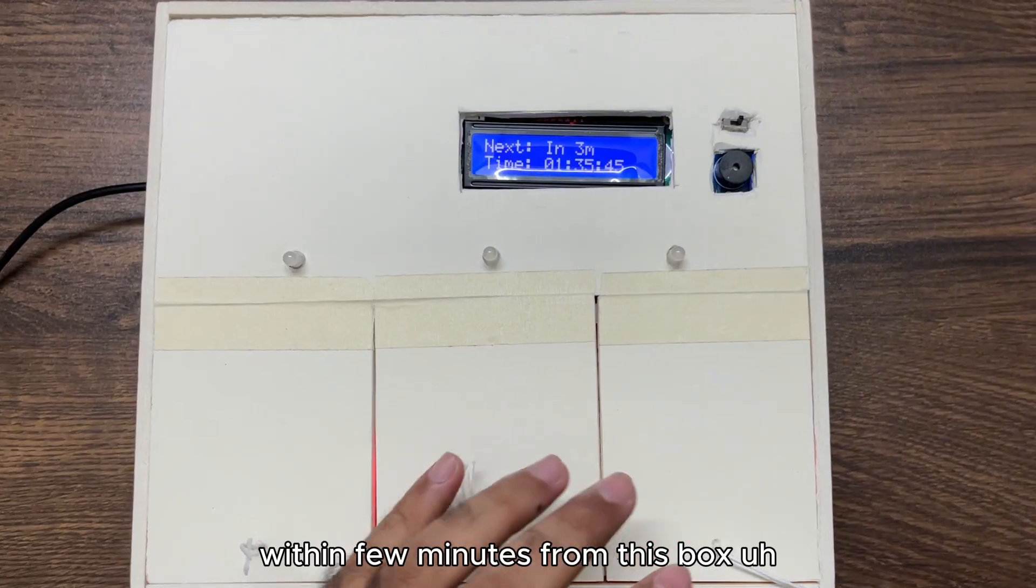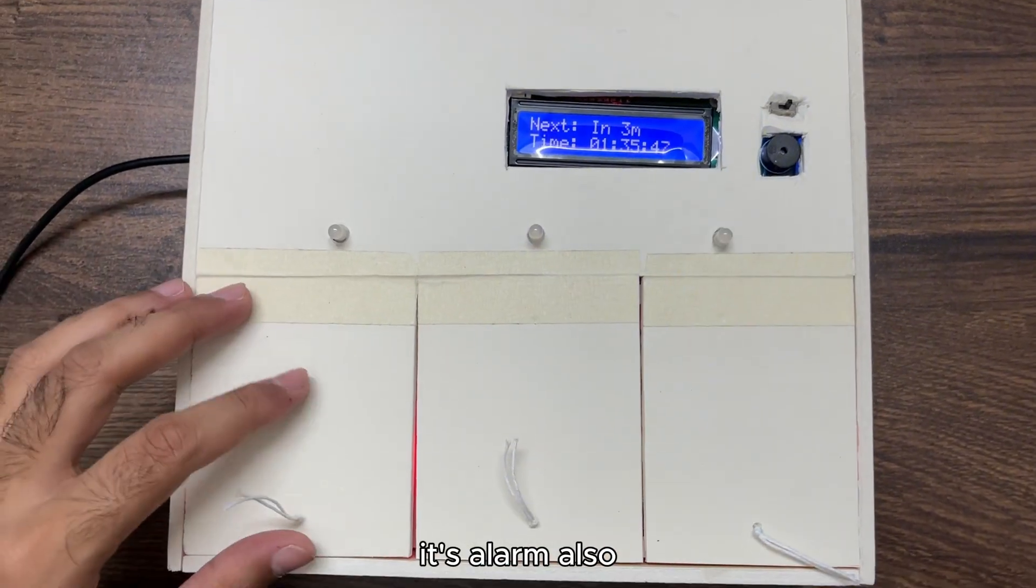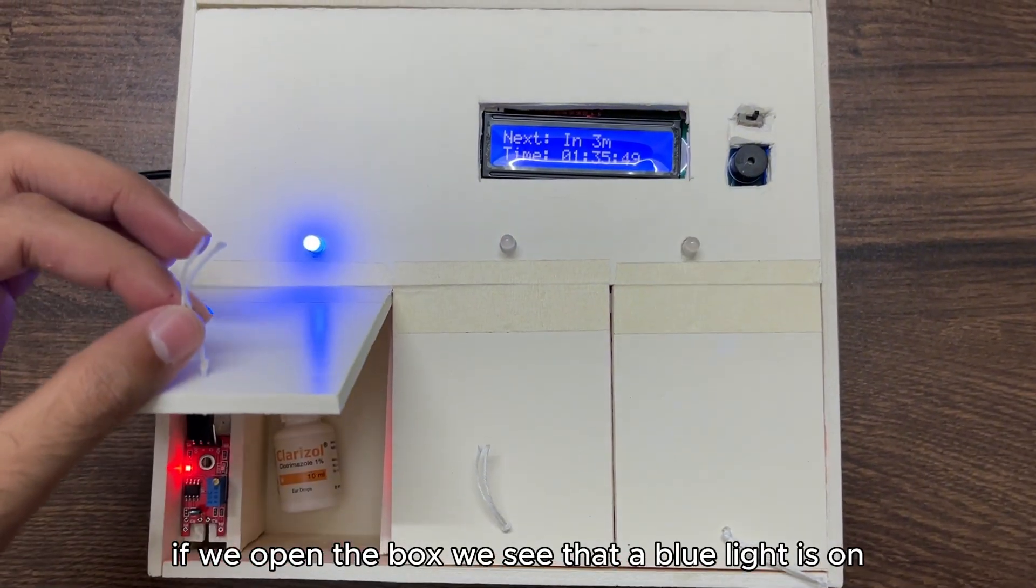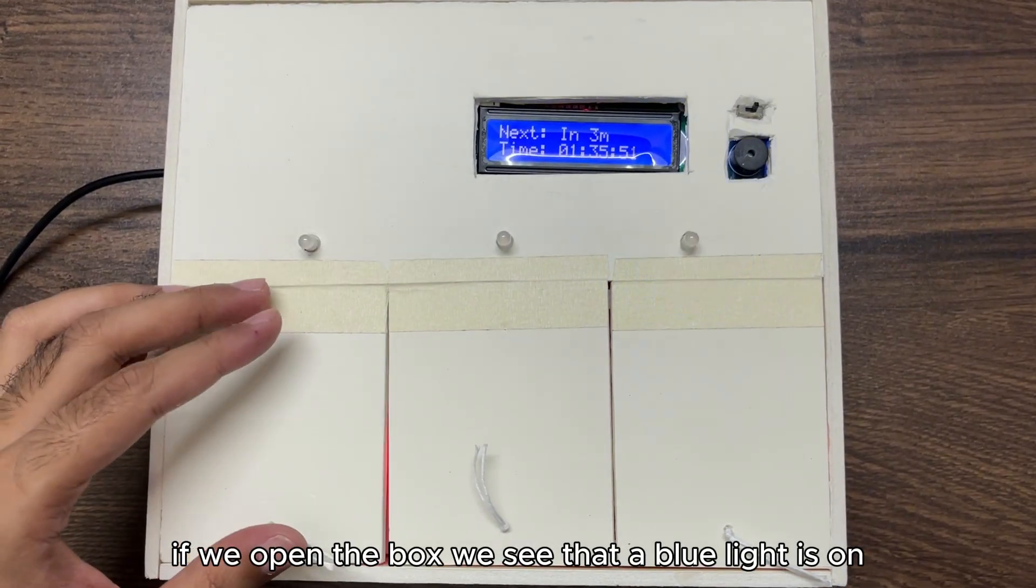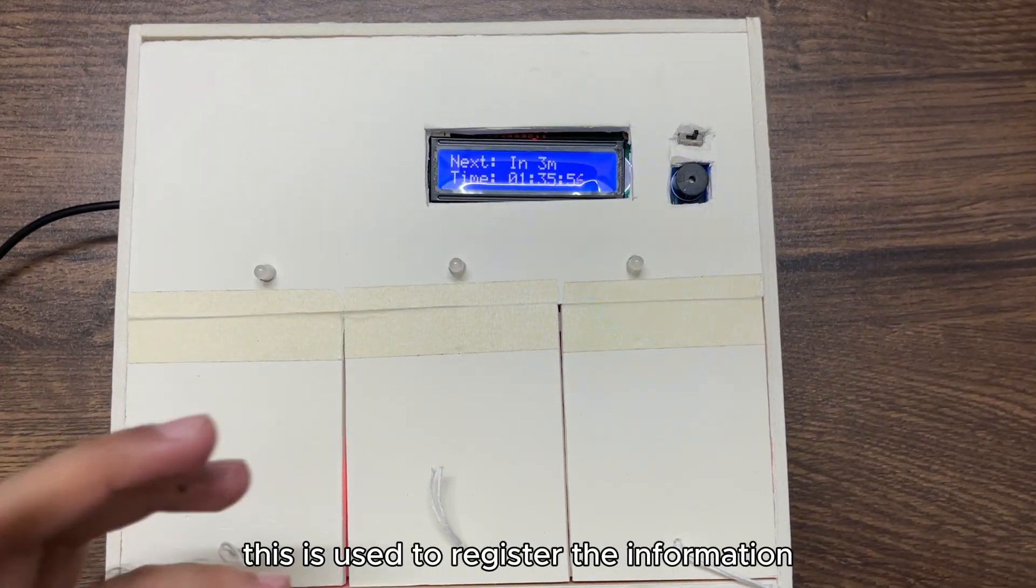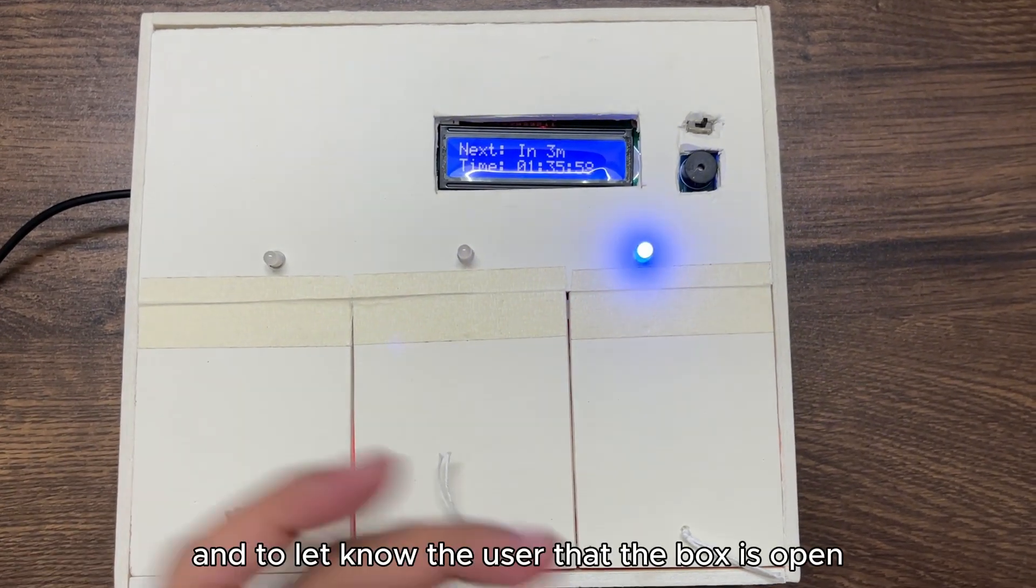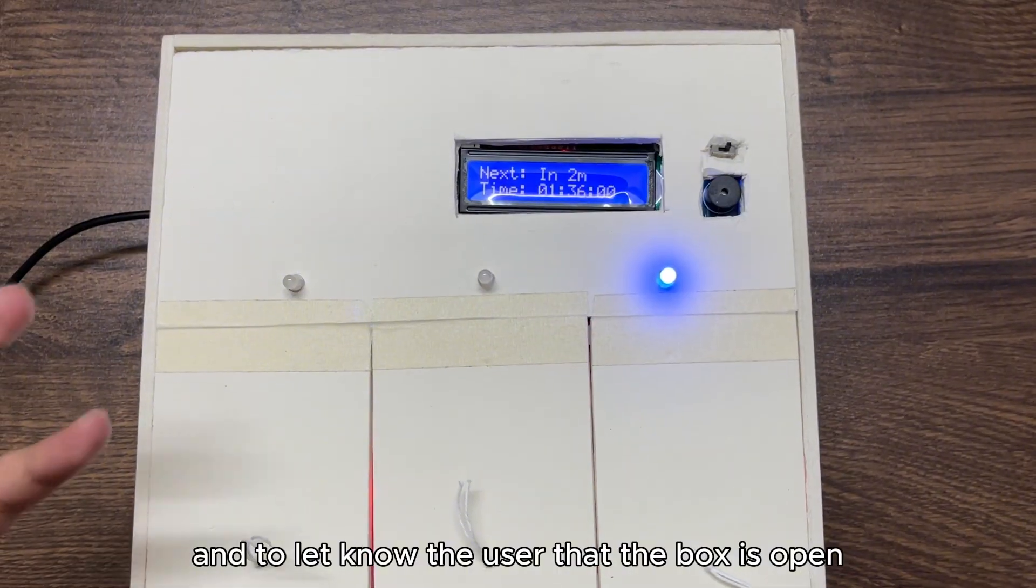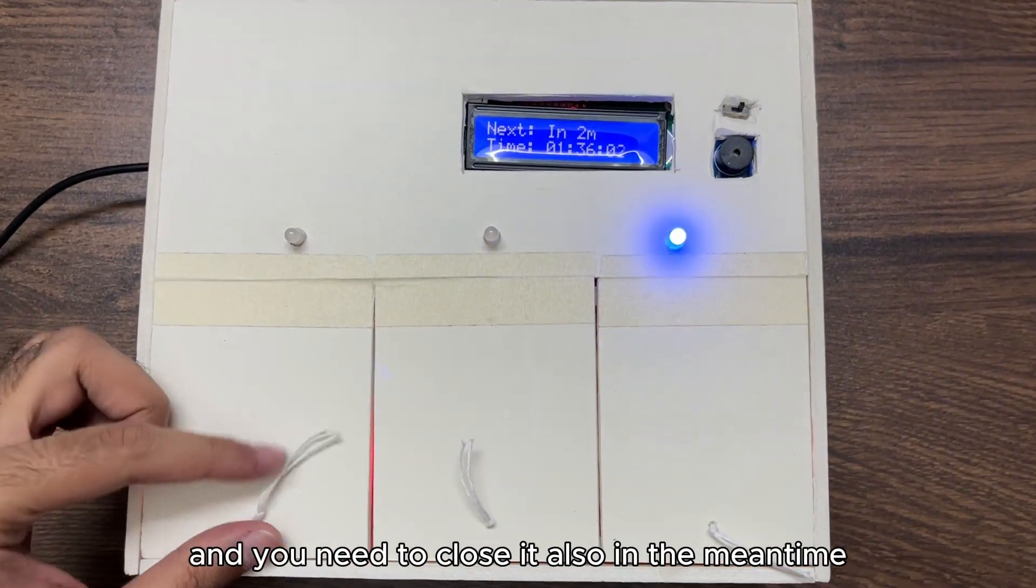If we open the box, we see that a blue light is on at the time when the lid is open. This shows that the box is open. This is used to register the information and to let the user know that the box is open and you need to close it.